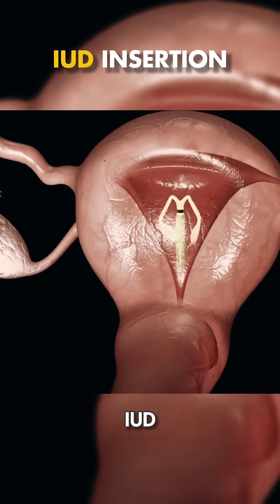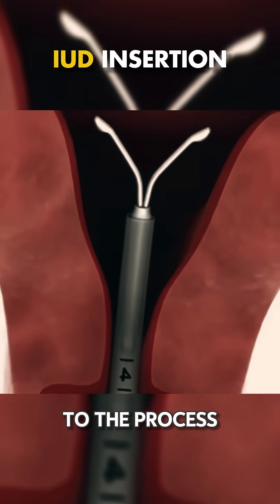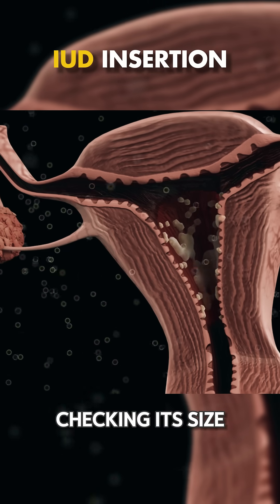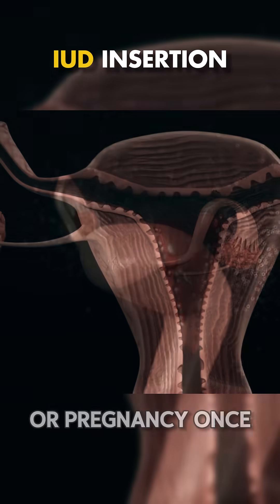Ever wondered how doctors insert an IUD? Here's a step-by-step guide to the process. First, the doctor evaluates the patient's uterus, checking its size, position, and ensuring there are no signs of infection or pregnancy.